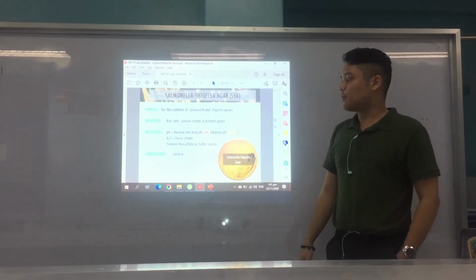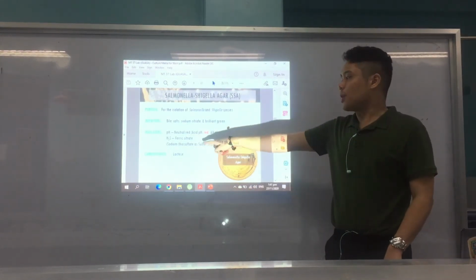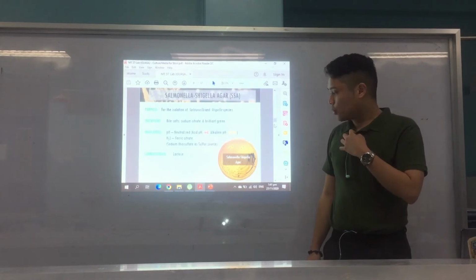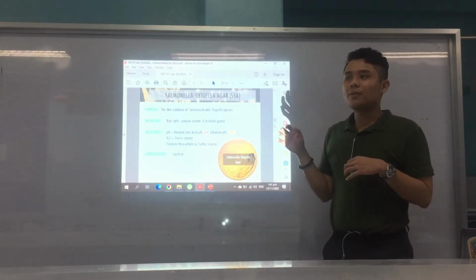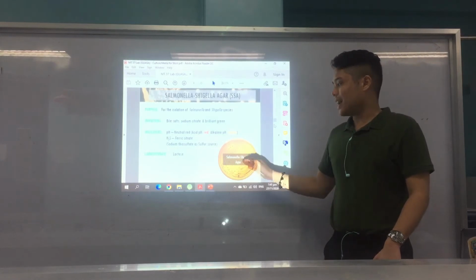And sodium thiosulfate as the sulfur source, same as with your TSI, right? As the source of sulfur. Okay, alright. And the carbohydrate there is lactose. So again, this is your Salmonella Shigella agar, one of the culture media used for isolation of Salmonella and Shigella, your SSA agar.